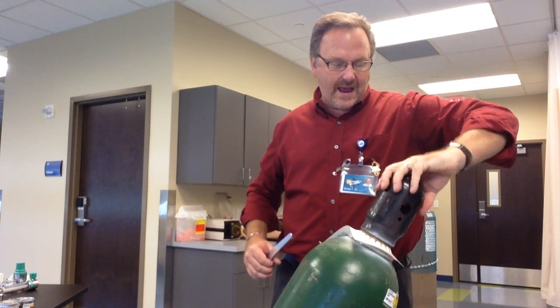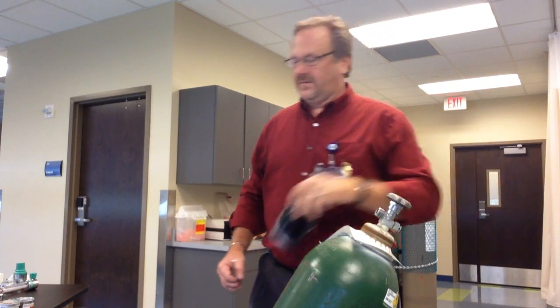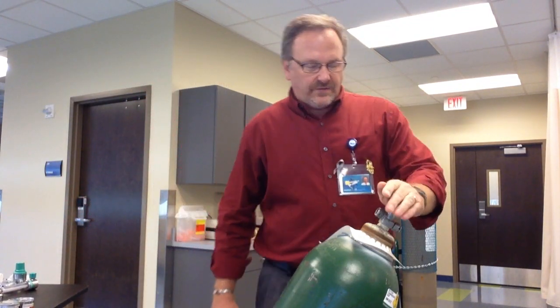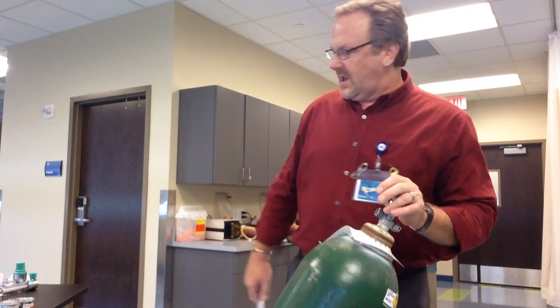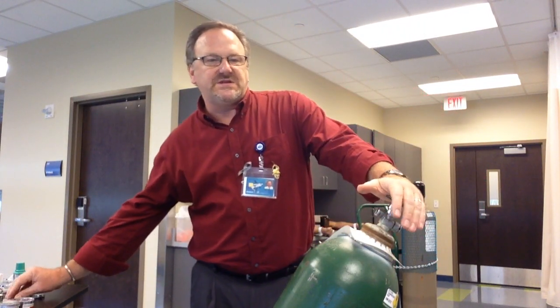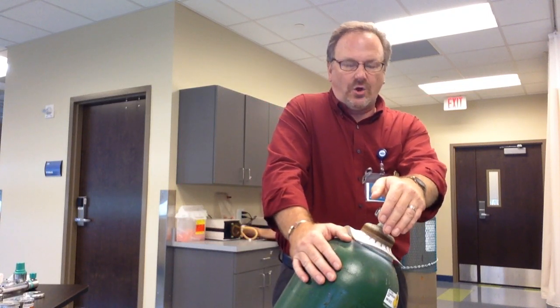Then you take your cap off. There's my stem. The first thing I want to do is make sure there's no debris in here. These tanks may have been sitting on the back dock, sitting in storage — who knows how long.